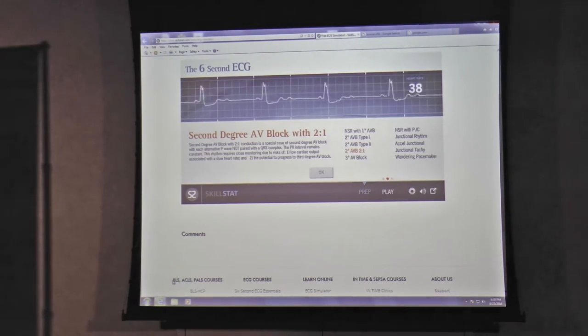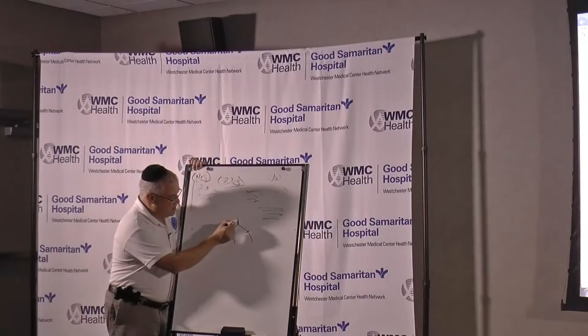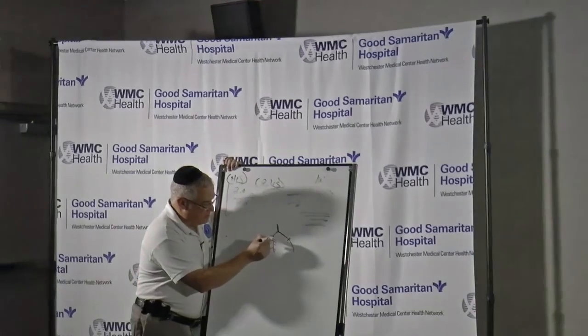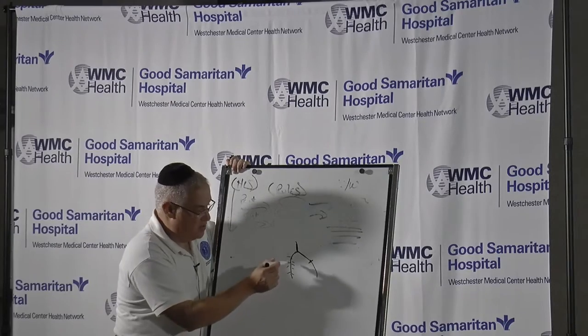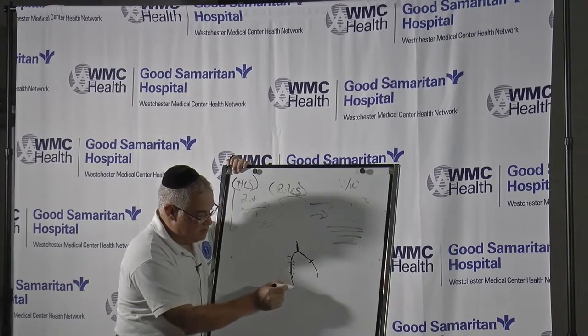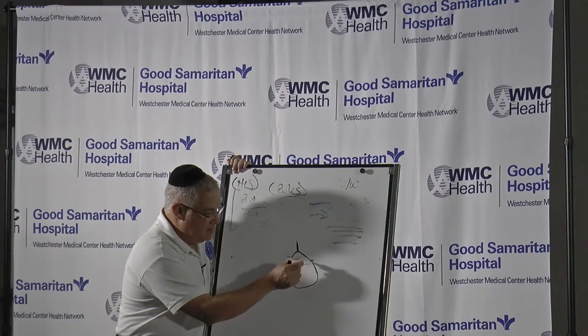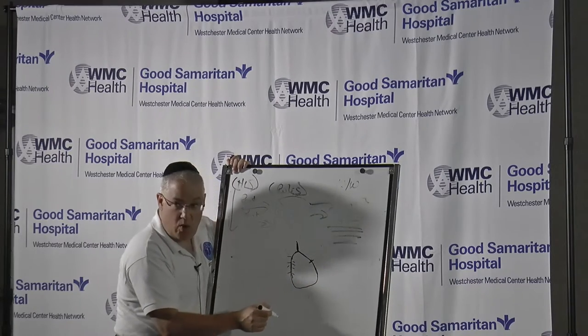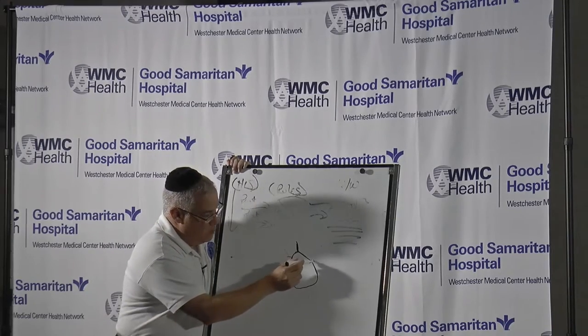When you come down into the ventricles, you have the bundle of His, and then it goes down into the bundle branches, and then off the bundle branches you have all the Purkinje fibers, right? So if you get a block, let's call it a left bundle branch block, the impulse is going to come down, and obviously they're splitting simultaneously. When it goes down here, it's going to stop. It's not going to fully depolarize the left side of the heart. This one is going to come down and depolarize like it's supposed to, continue traveling, pass the septal wall, come back around, and depolarize the rest of it. And there you would get a wide QRS with the bundle branch block. So that could be why we're getting that wide QRS with the notch.